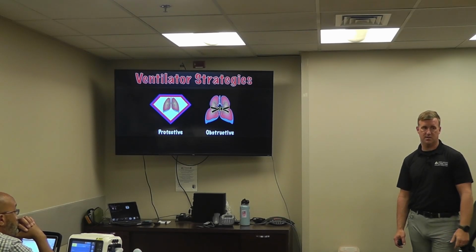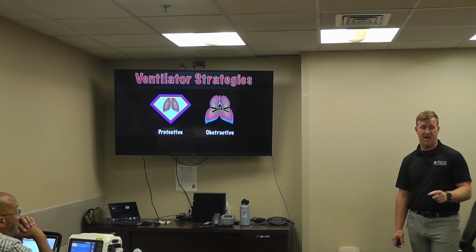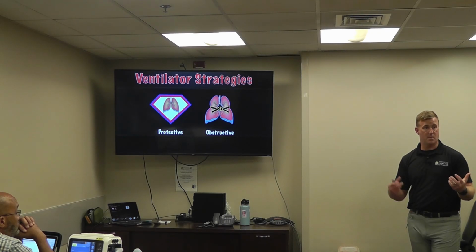Okay, altered mental status. CHF. So it's somewhat of a trick question because it's everybody who's not obstructive. So we use the lung protective strategy on everybody who's not obstructive.